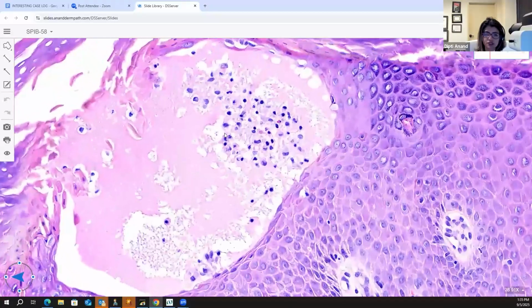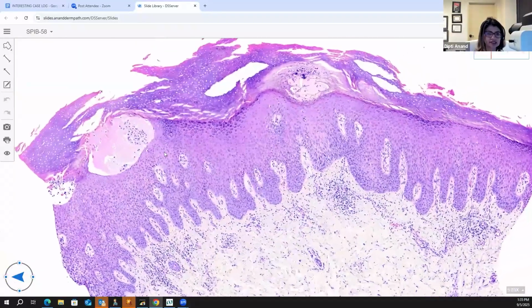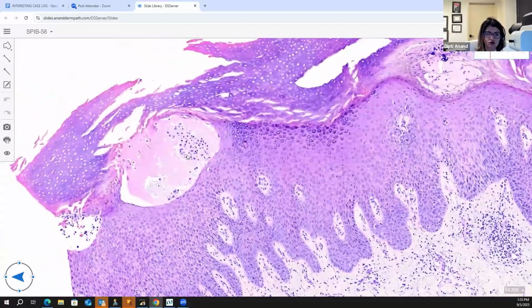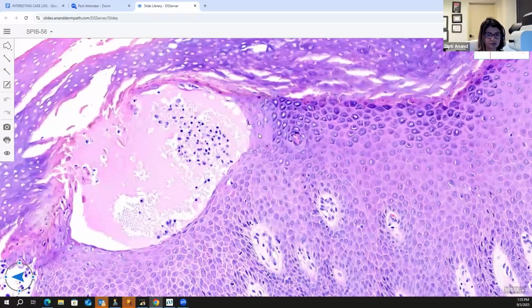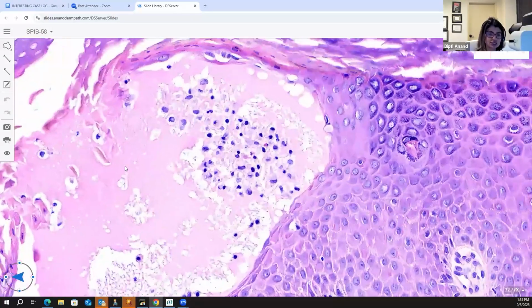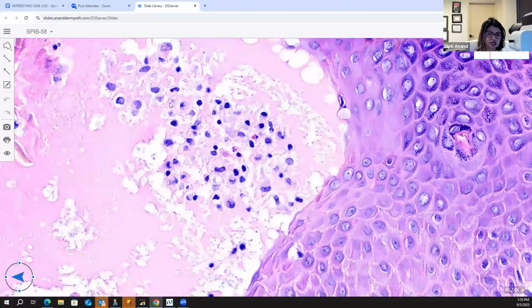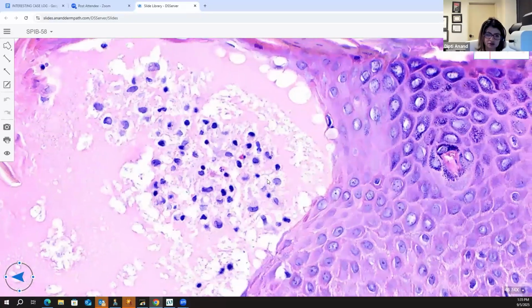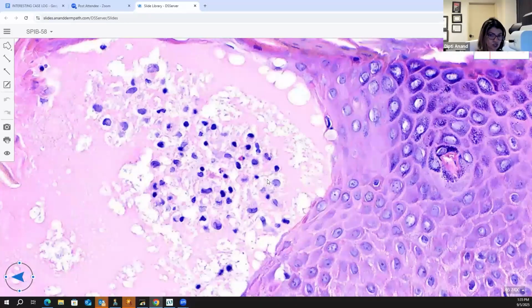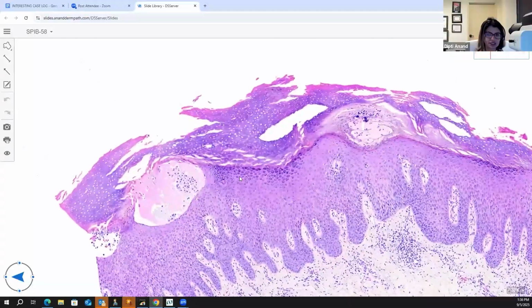So, you know, in general, this is actually dishydrosis. And the reason I would say that is because generally in palmoplantar pustulosis, when you see this subcorneal pustule, you don't see this amount of fluid, and it's predominantly pustule, it's neutrophils. Like right over here, I'm actually not seeing neutrophils. There's an EO, there are some lymphocytes, and there are histiocytes, right? So this is probably more like dishydrosis or contact mediated.